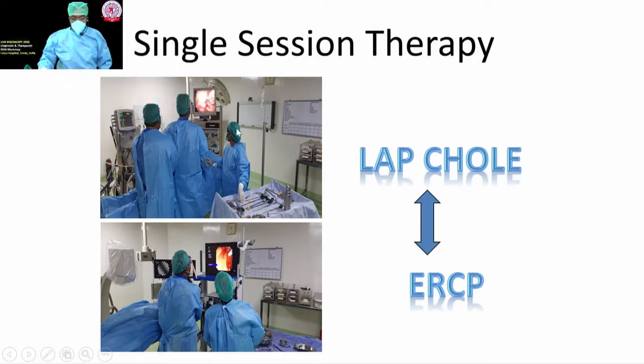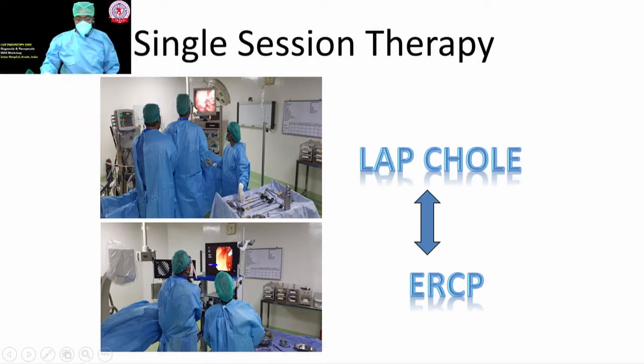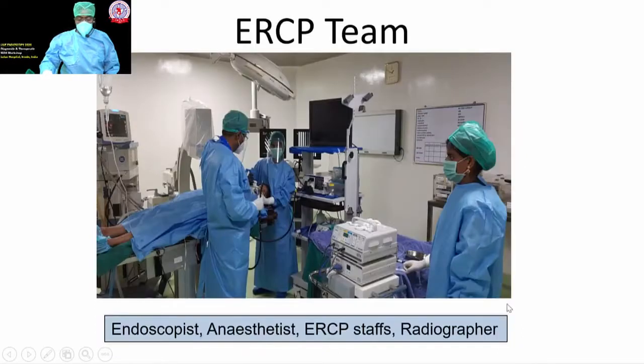In this particular patient, we just ended up performing a lap chole. Now we are moving into ERCP. Hopefully it should be okay. And this is the in position. As you can see, we can put the patient either supine or prone. Today we are going to have a prone patient, because for a beginner that is quite a comfortable position. And ERCP is a 4-letter word, it needs 4 people.